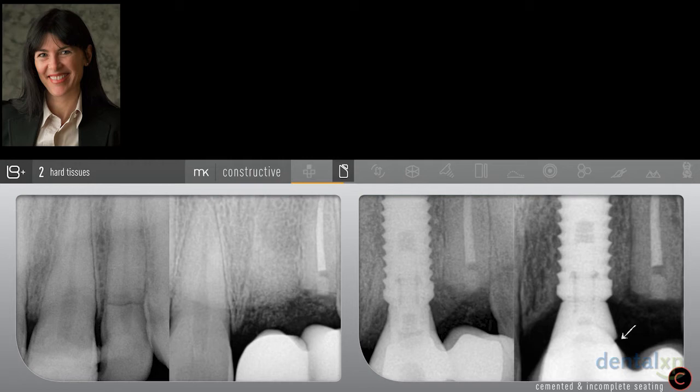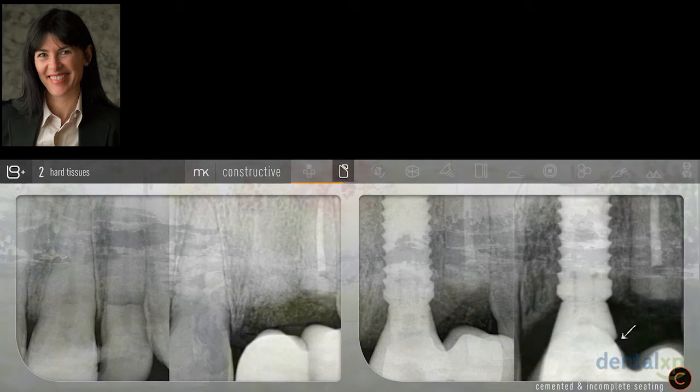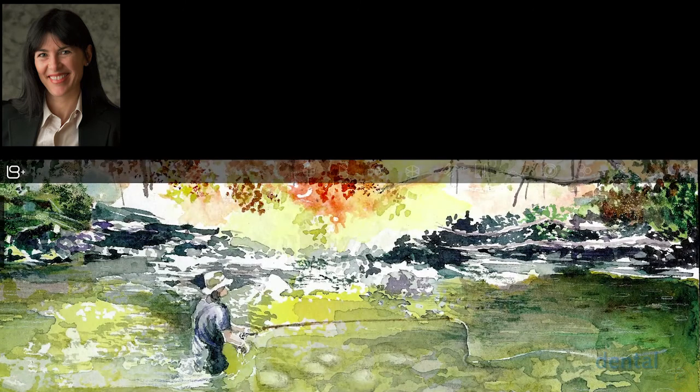I mean, the more I look and read journals and so on, this is something that plagues us when it comes to cement-retained restorations. Now, what's the problem for us? This is a nidus for bacteria. This is a problem that sets us up for peri-implant mucositis and in some situations peri-implantitis. So it's something we want to avoid. But this is basically a redo at this point in time. So, we can have a vision as to where we want to end up, but this stresses the importance.